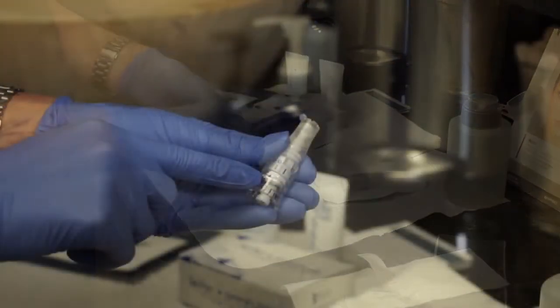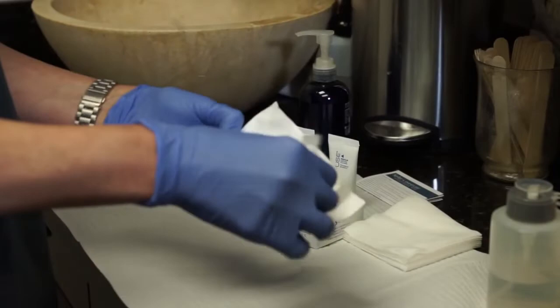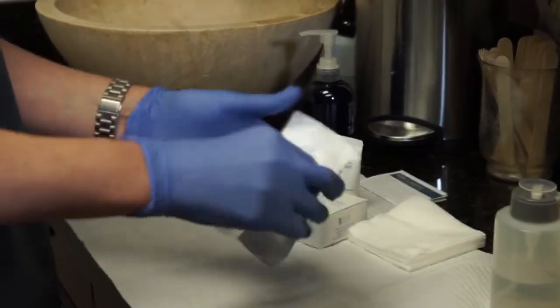Installing the cartridge. The SkinPen cartridge is unique amongst its competitors as the reciprocating mechanism is housed within the cartridge, not the device. This allows for a precisely calibrated cartridge with each application. Because of this, and the fact that each advanced cartridge unit has a lockout feature for safety, special attention is needed to install each new cartridge. Start by removing the paper backing on a new cartridge.